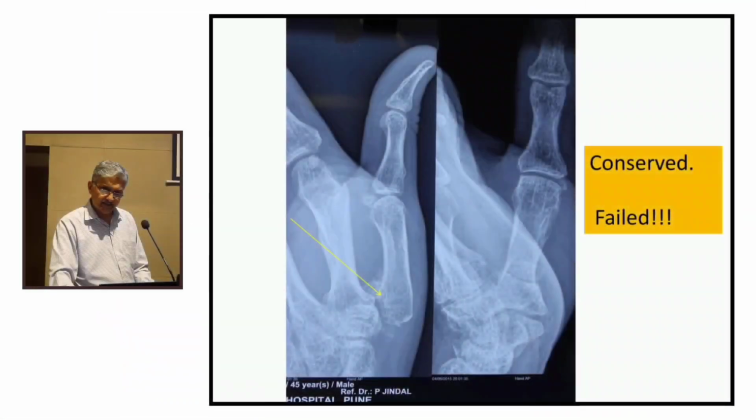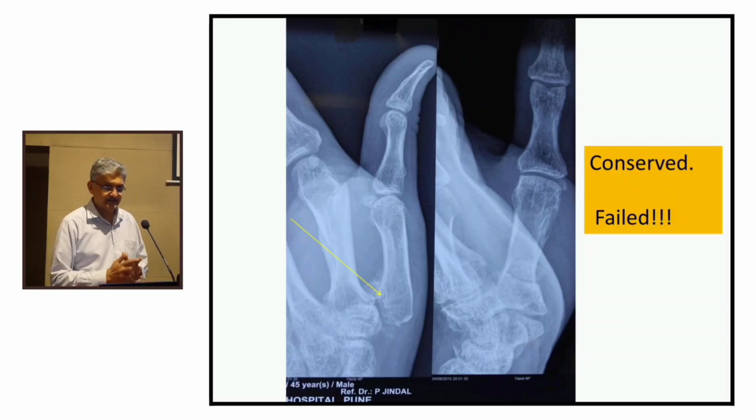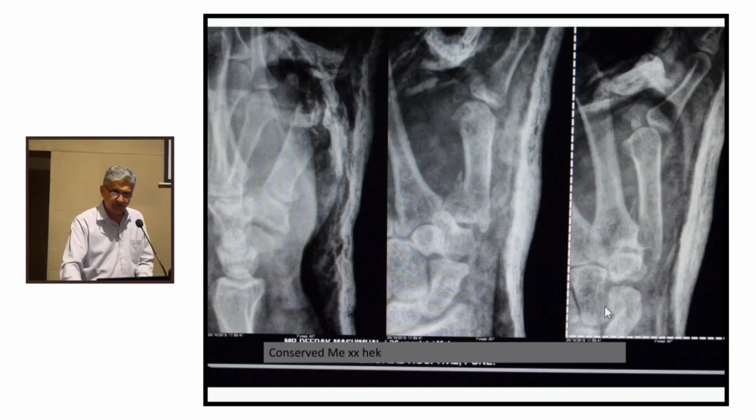This was managed conservatively. What you notice, this is the trapezium and the whole metacarpal is falling apart under the pull of abductor pollicis longus. So the first metacarpal base fracture is unstable and therefore has to be relocated. On the patient, you notice here, while the volar medial fragment is sitting nicely on the trapezium, the lateral radial fragment is gradually shifting more proximally under the pull of abductor pollicis longus, and therefore the base of the proximal metacarpal 1 requires surgery.